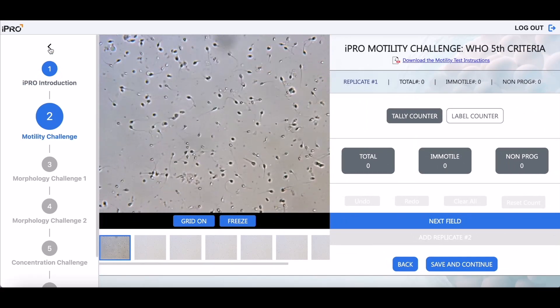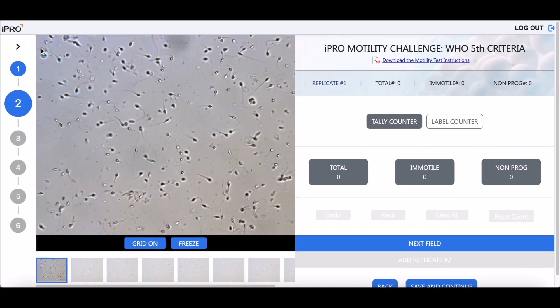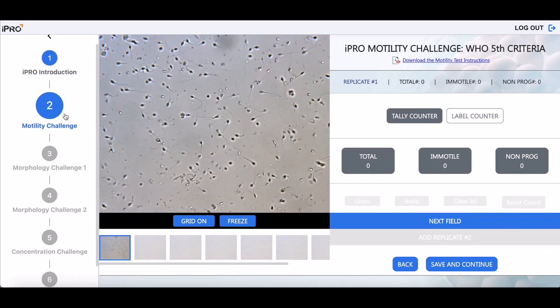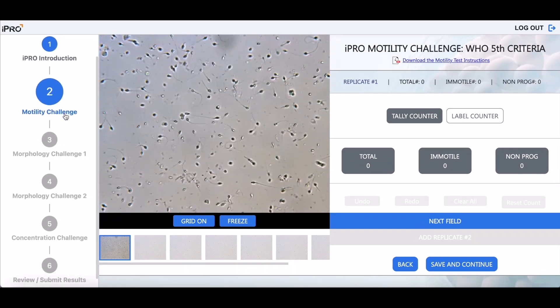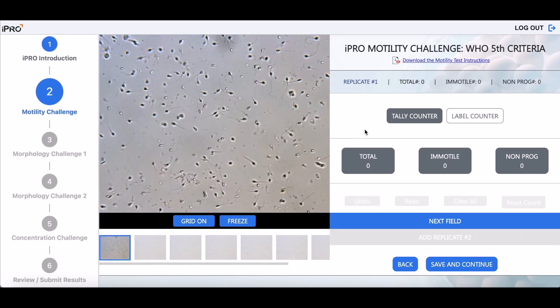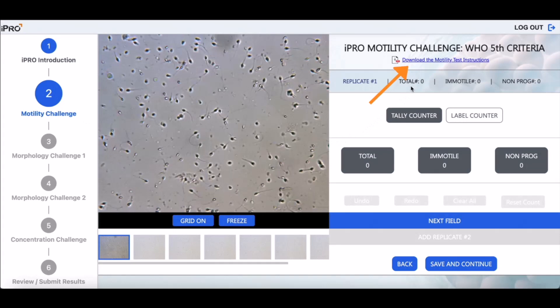Use the iPRO navigation bar to track your progress as you move through the proficiency challenges. Refresh your knowledge of the WHO guidelines for sperm motility, morphology, and concentration by clicking on the instructions before beginning each challenge.